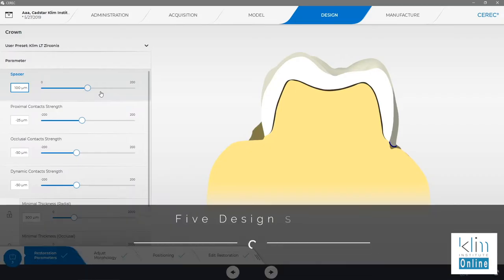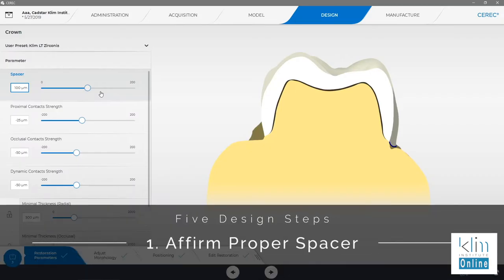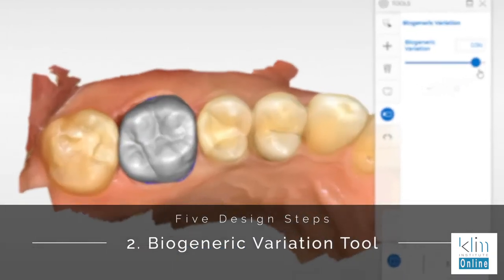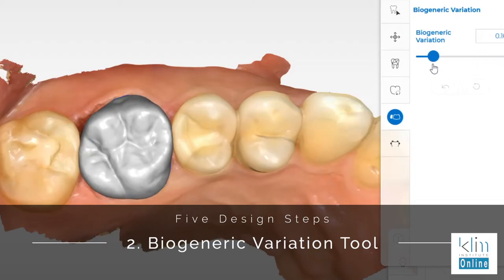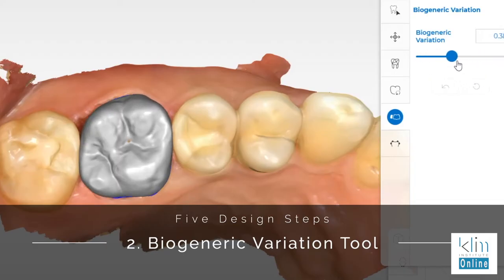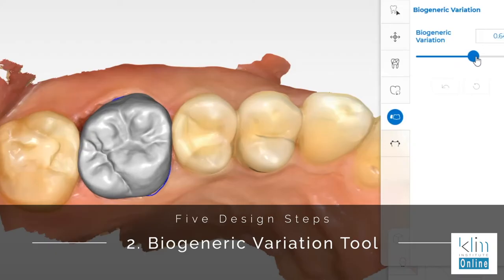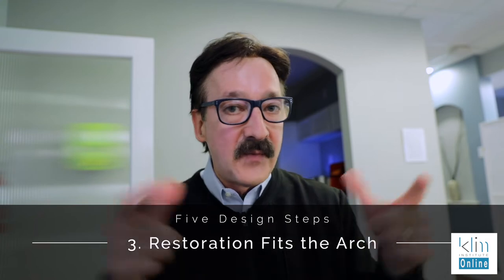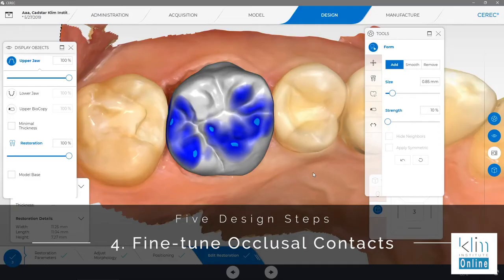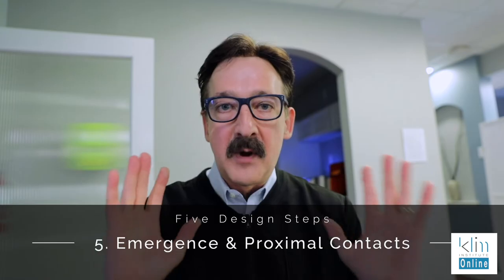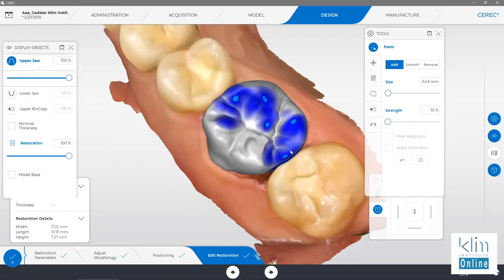Number one, I always check my spacer as soon as the restoration is proposed. Then I consider the biogeneric variation tool if I need to use it, which I do a lot. That way I can customize that beautiful morphology we see in this software. Then I'm going to go through the last three steps: setting the restoration up to fit the arch, fine-tuning my occlusal contact profile, and setting up my interproximal contact and the emergence so these restorations drop in and we don't have to touch them.